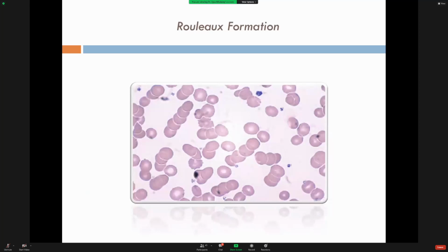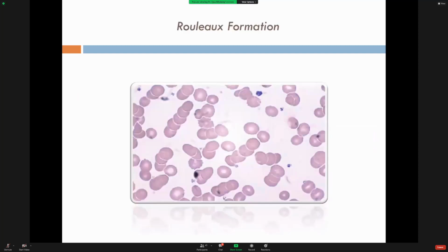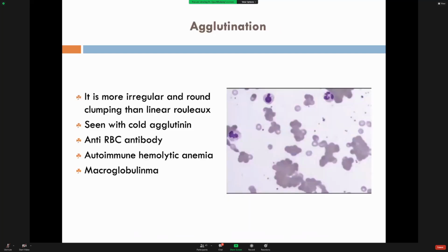Yeah? This is again Rouleaux formations. تكلمنا أمس عنها. It looks like a red blood cell like coins sticky together. More than 5 we consider it Rouleaux formations. Common example اللي هو multiple myeloma. الأذرز تكلمنا عليها أمس اللي هو infections, TB, high proteins, myelofibrosis لكنه commonest example هو multiple myeloma.